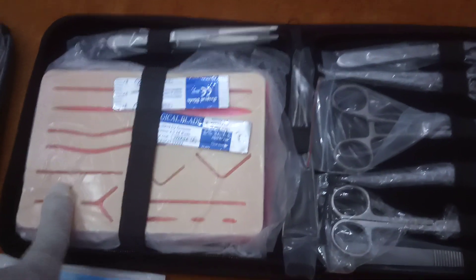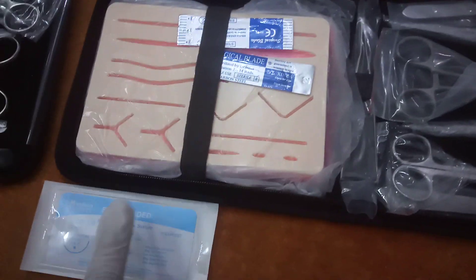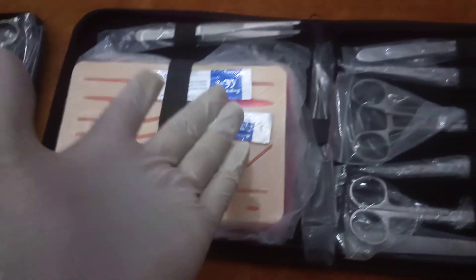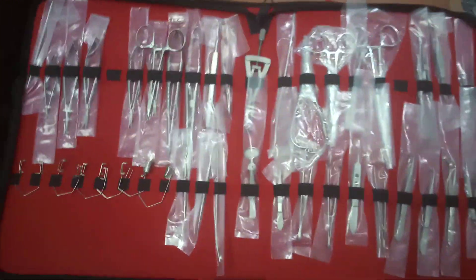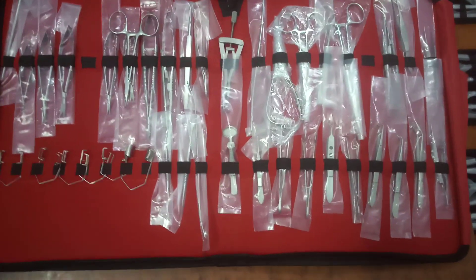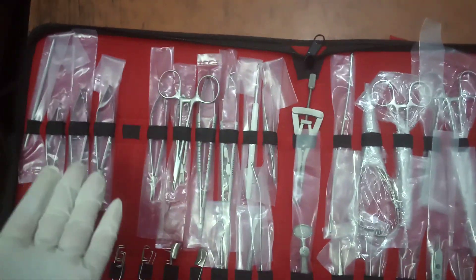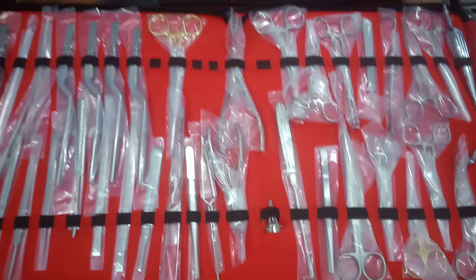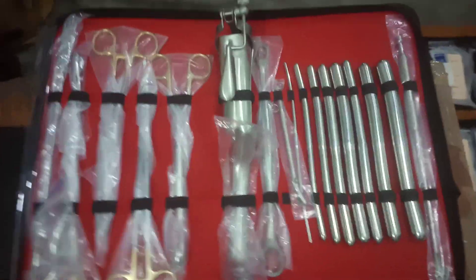It helps the student to learn multiple procedures in the future. We are providing suture thread and scalpel blades. It is also used in eye surgeries, retina tumor treatment, and many things — it is also used in brain surgery, and we have multiple scissors as well.